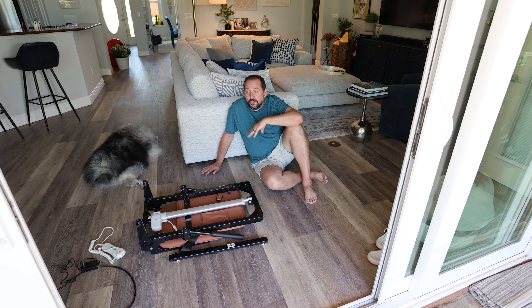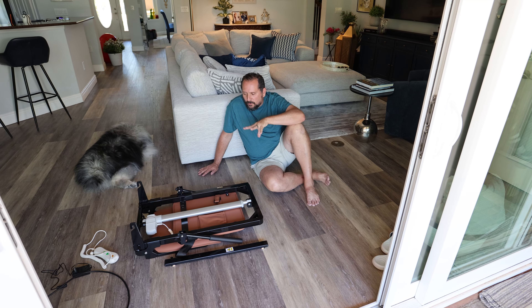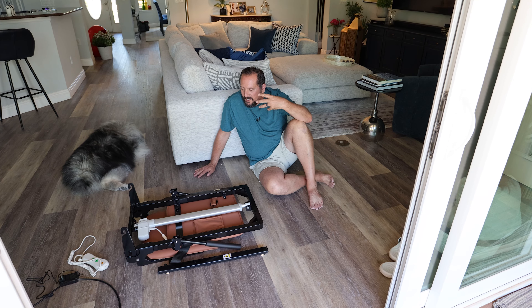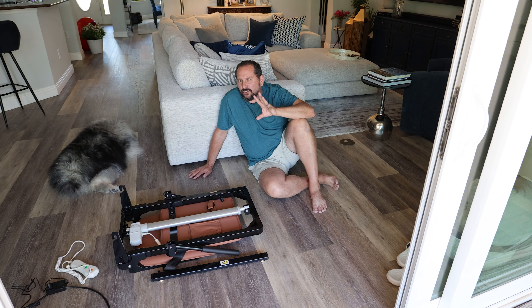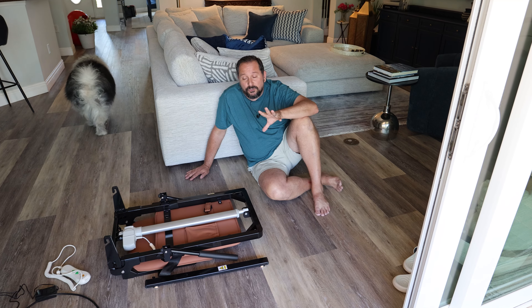This is a lifting chair which seems to be mind-blowing cool for what came out of this box. I was expecting to have to assemble a lot of stuff, but I took it out and it looks so simple to assemble — and once assembled, it is so useful.